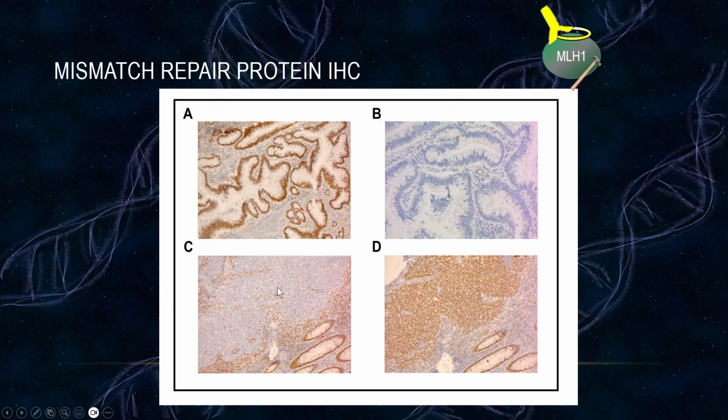And it looks like different tumors are different levels of differentiation here, kind of a well-differentiated nuclear loss, and then maybe a more poorly differentiated tumor. And when you do these, you often have internal controls, lymphocytes, normal epithelium, so you can see the surrounding normal tissues are still intact here, still positive. And then same here, even a case that's intact, positive, you can still see it staining over here.